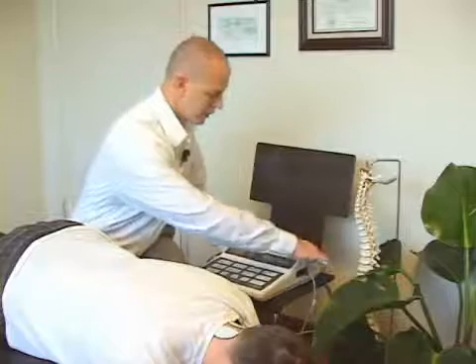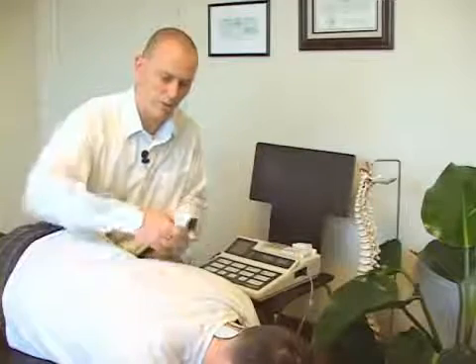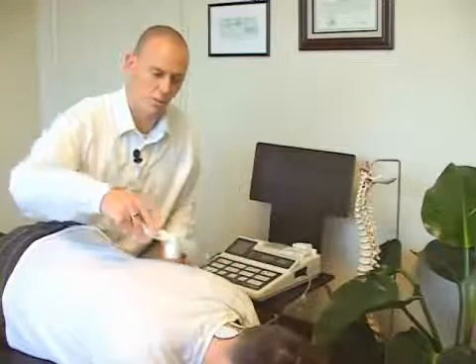With the ultrasound unit, we're going to take the wand, and we can combo this or we can do them individually. We put some gel on the area in question, set this for 3, 4, or 5 minutes — whatever the case may be — and we basically keep this in motion over the area of the soft tissue of the musculature that we're working on.